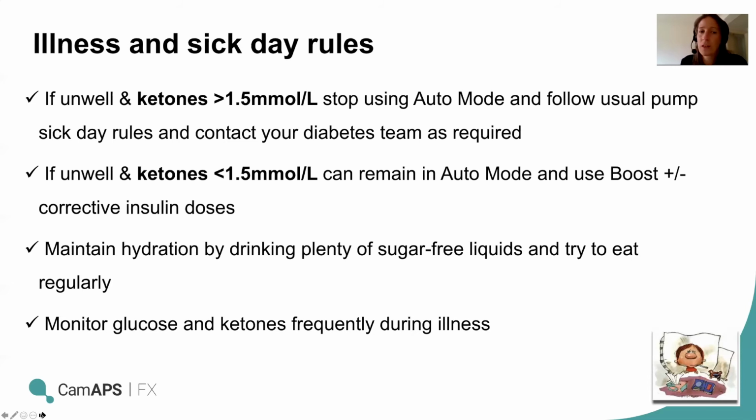If you're unwell and your ketones are less than 1.5, you can usually remain in auto mode and use boost plus or minus manual corrective insulin doses as you need. And often we find that the boost can correct things anyway, because it will increase the insulin delivery.